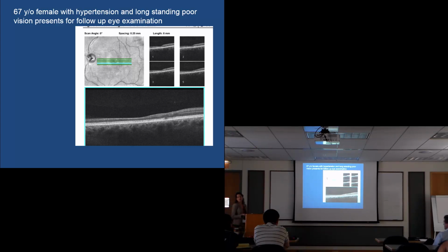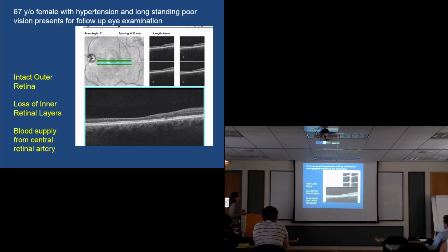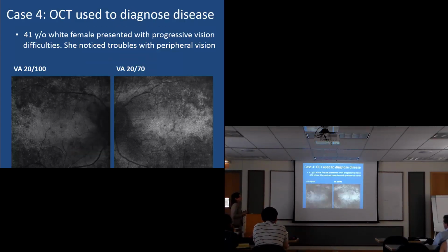And these patients right now have no treatment. So hopefully one day we can do transplantations or stem cells; different layers are being looked at to transplant into patients. But it's really, you see so much healthy retina, but this patient has a complete black scotoma wherever the neurosensory retina is missing there too. So it talks about looking at anatomy.